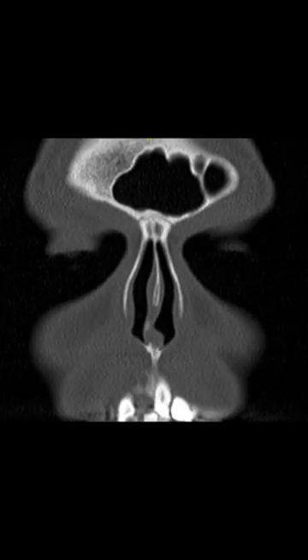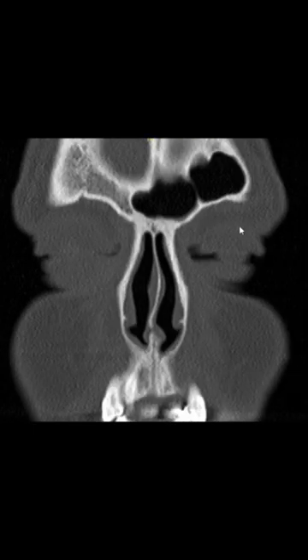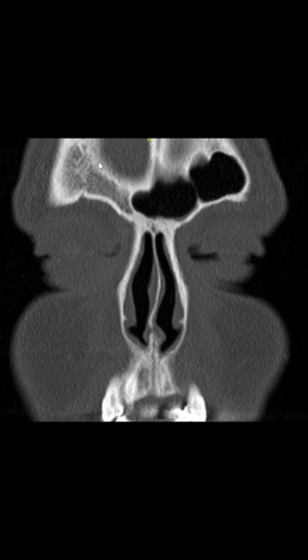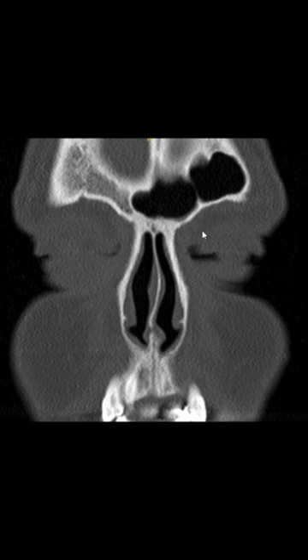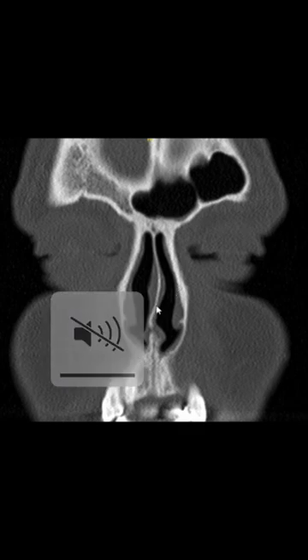We do not see any septations in the initial cut. As we go further in, there is a really interesting finding: there is a septation in the left frontal sinus, and the right frontal sinus is absent. Further, there is a slight deviation of the septum to the left side — that is okay. This is the beginning of the orbit, and the eyelids are clearly seen.